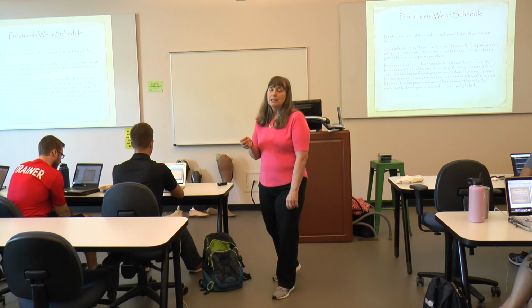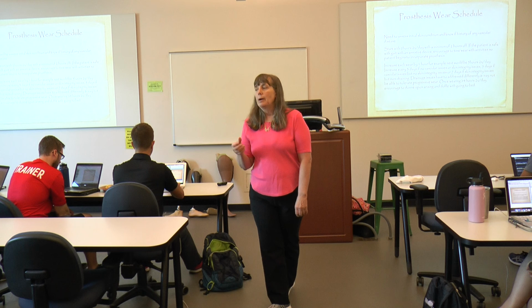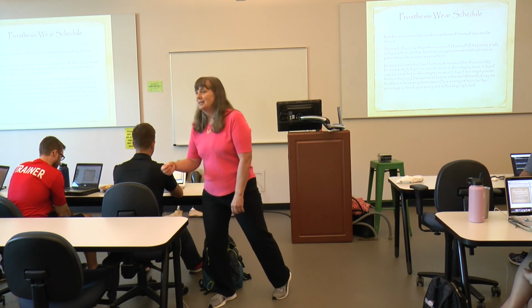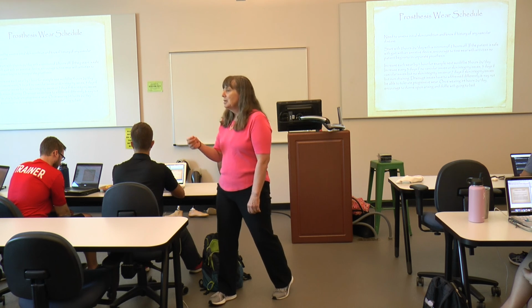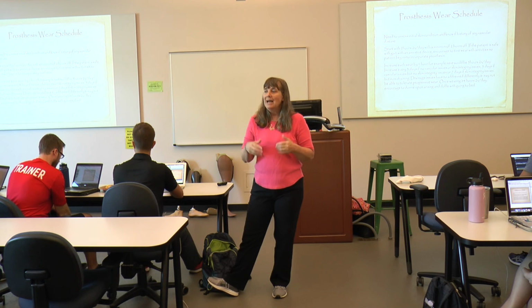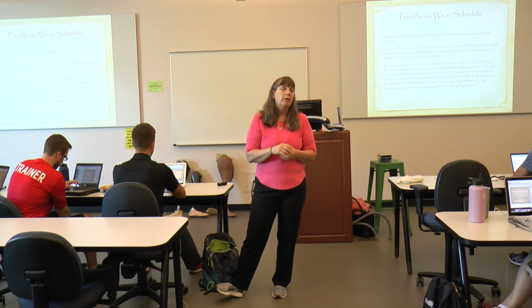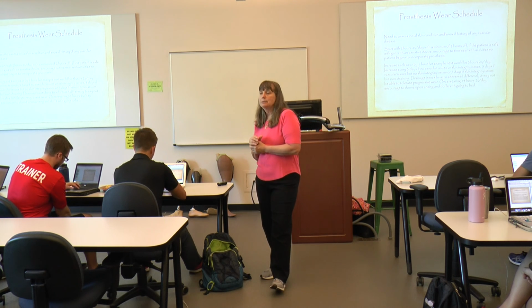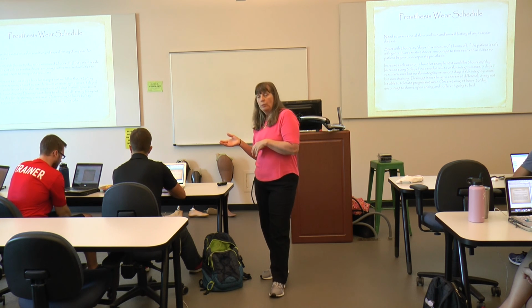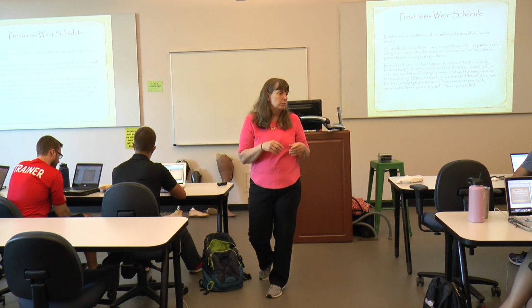But if there are no skin issues and there are no pain issues, you actually can go up an hour. So I would go to 2 hours twice a day, 3 hours twice a day, 4 hours twice a day. You see where I'm going with this, ladies and gentlemen? We get up until we run the times together. As the time increases, we will be drying it for sweat. When I get over about 4 hours twice a day, I ask them to take it off at the midpoint of that and dry it automatically. Or if one of the signs of sweating that we're going to talk about after the break are present, to dry it then too. Okay?